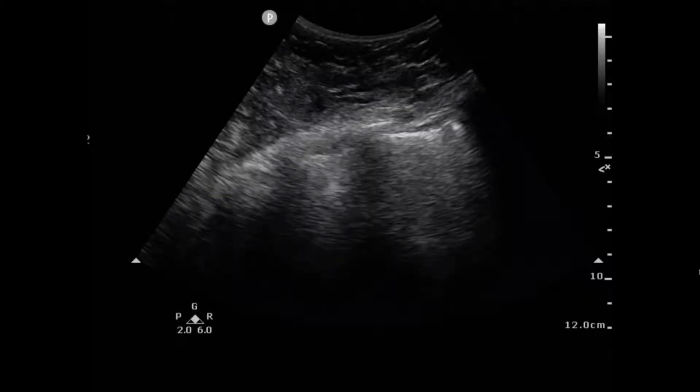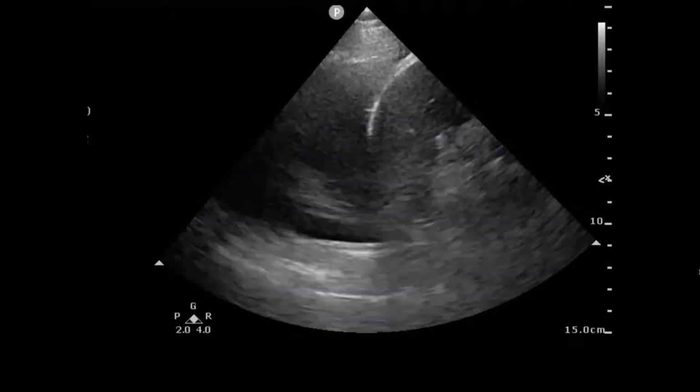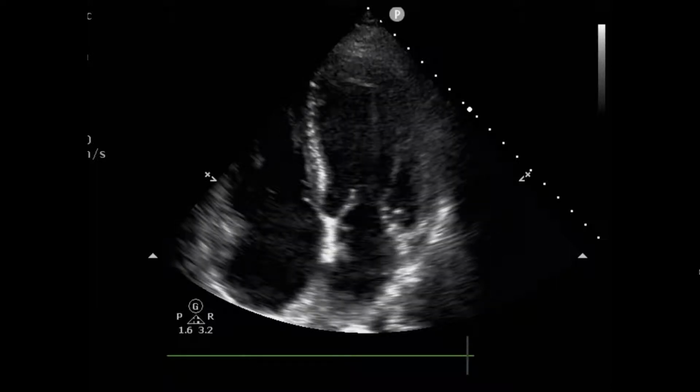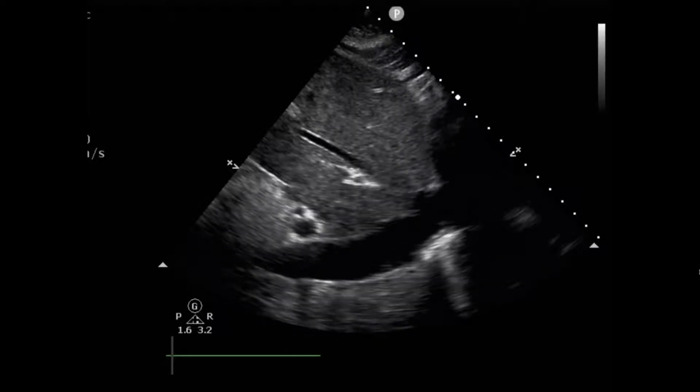We performed a focused assessment with echocardiography in this patient, and we found a moderate systolic dysfunction and dilatation of the left ventricular chamber. And the IVC, as you can see here, was enlarged and without compression or decrease in diameter with inspiration. So we made the diagnosis of heart failure. This patient was misleading us toward different diagnoses, but we treated in the right direction right away at the emergency department.